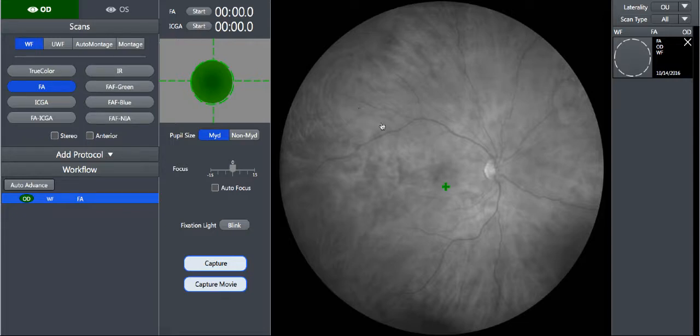This is my live view. This represents the eye of the patient seated at the device. And this little green thing, I'm going to make it blink for a bit. This is the fixation point indicator showing where the patient should be focusing their gaze. If you click on the main viewport, the fixation point will move to the preset closest to where you clicked. You can also drag it for more customized positioning.